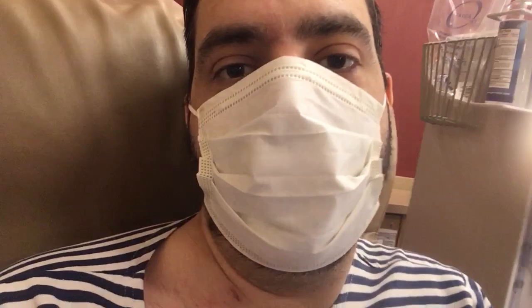I'm afraid I'm gonna yank on your hair — go ahead, it's fine. If you're really hairy, this is the hard part, but I'm so used to it now that I don't care about a little bit of hair getting yanked. If you're a little squeamish, this is just the least bit of it — this is really just the easy part. The nurse agrees.